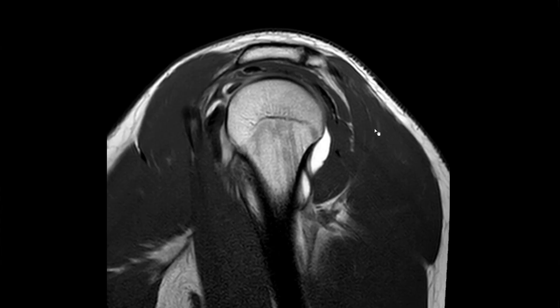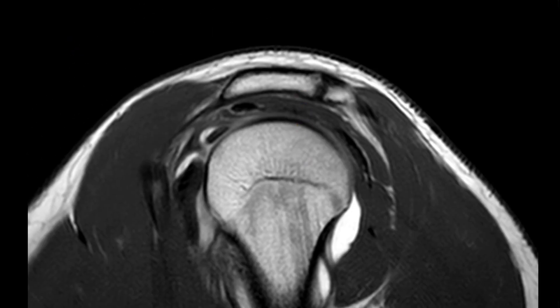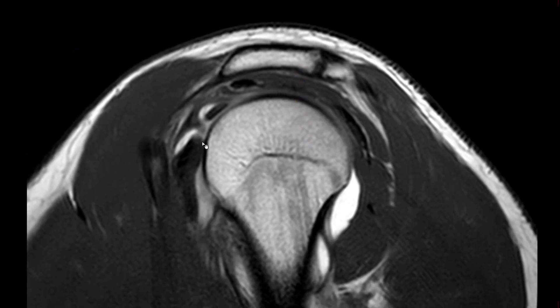What I'll do next is show you just a few cases with the anatomy and how it might look on MRI. This is a sagittal T1-weighted sequence after MR arthrography, at the level of the rotator interval. This is the long head of the biceps tendon — basically the same image I showed you just beforehand.